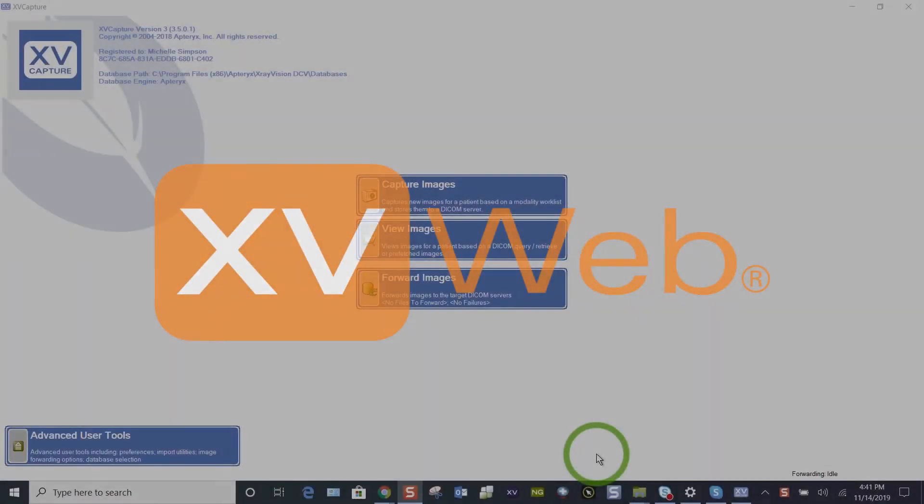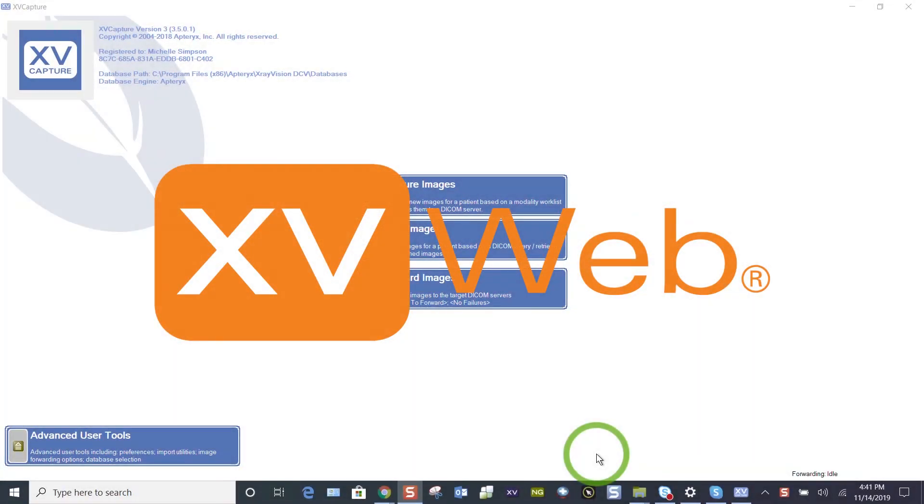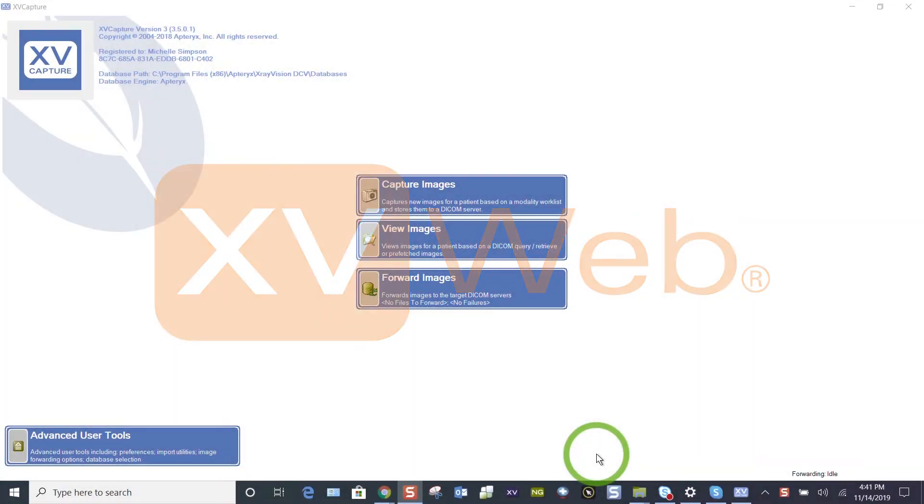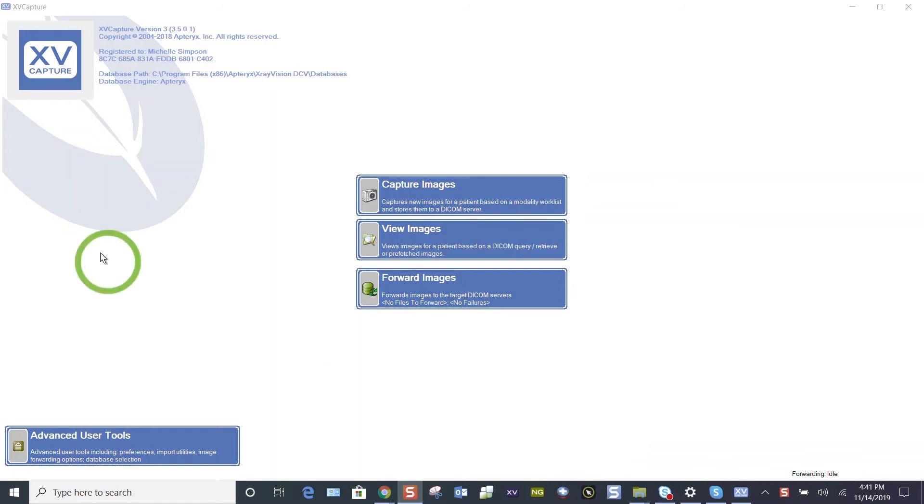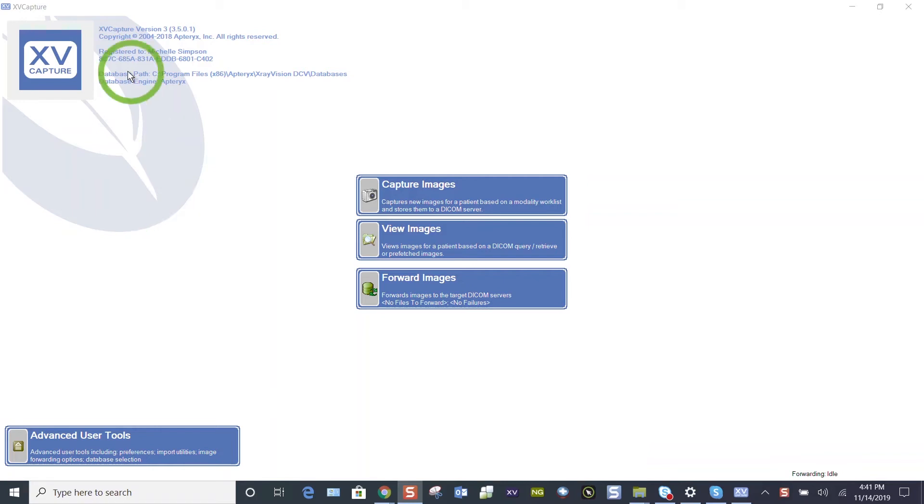This is a quick tutorial on how to take an FMX 18 with XV Capture 3.5. When you log in, you want to bridge to this page from your practice management software using the prompts associated with your office's practice management software. Once you're here, you can identify which version you're using in the upper left-hand corner.